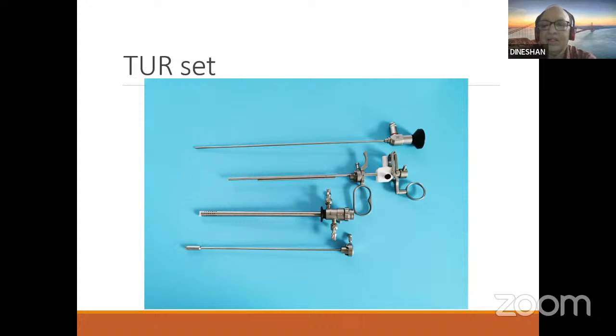And about when I discussed the telescopes, I forgot to mention, I showed you the pillar separately, the light pillars. Here you can see the light pillar. For each make, you have a different type of light pillar, which will accommodate the particular light cord. So if you have a different make of this light cord and pillar, there is a mismatch.